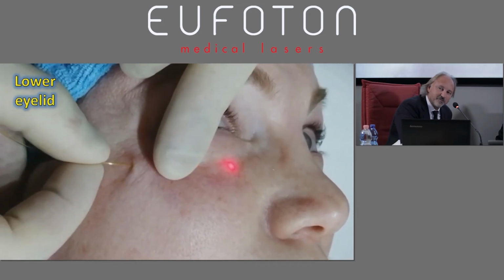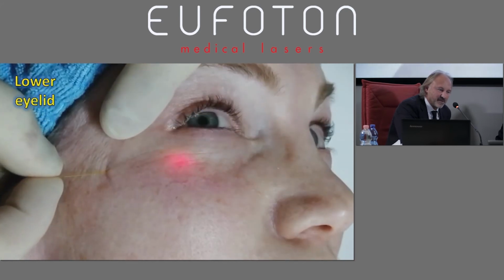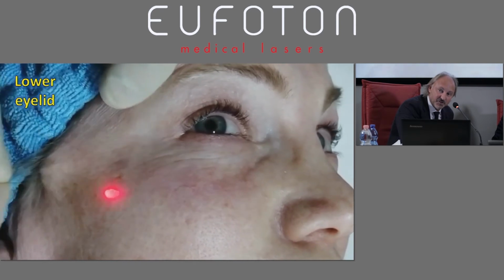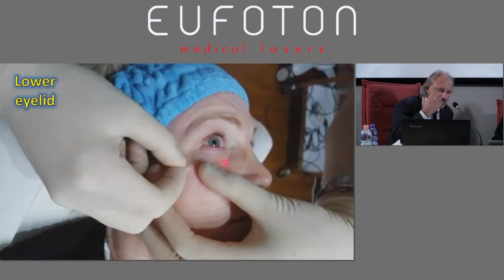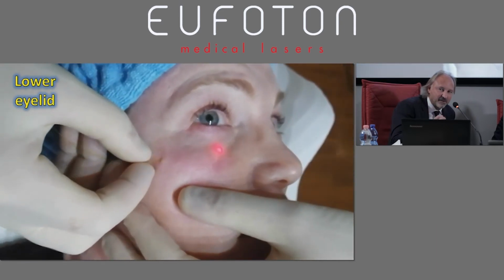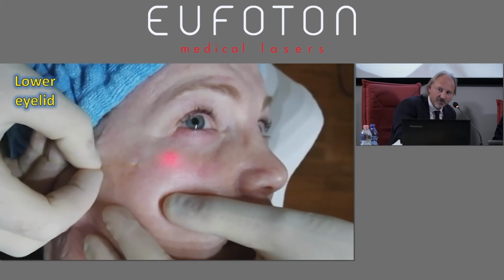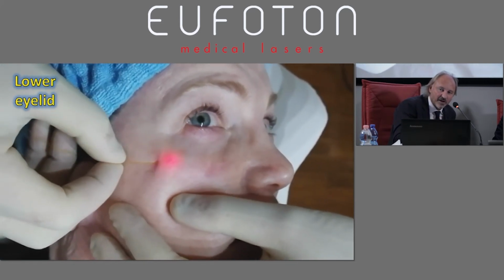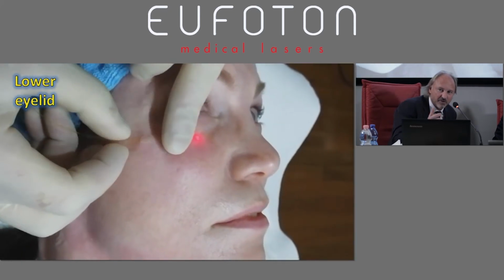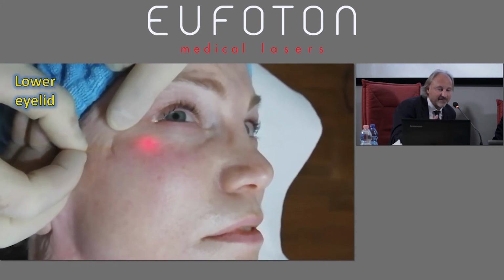That's a multiple response. If I want to increase energy, I do this. So the festoon, very well. So in the more zygomatic part of the festoon, I slightly increase the quantity of total energy emission, just telling the patient that the sequelae will be different.